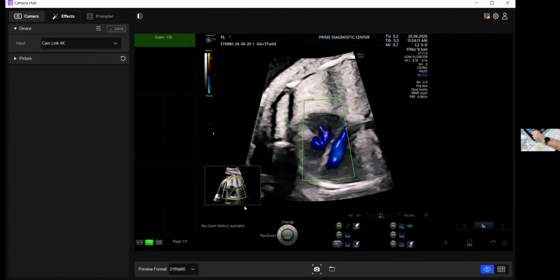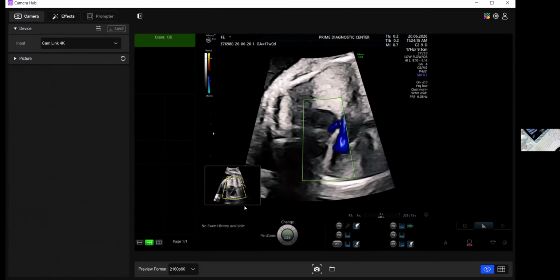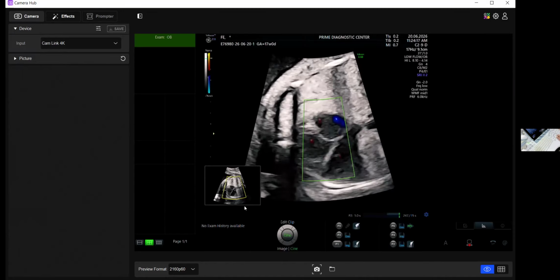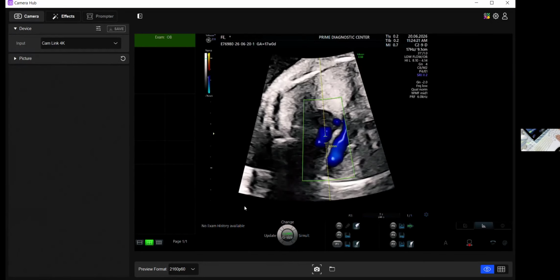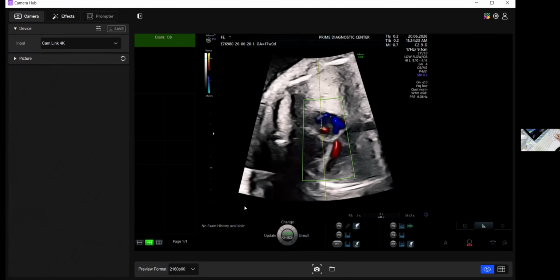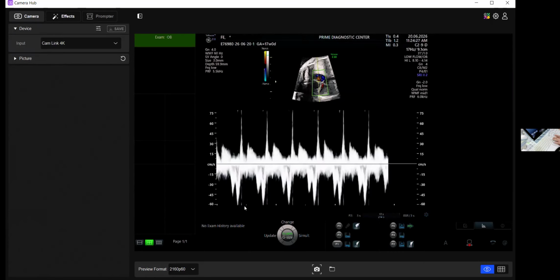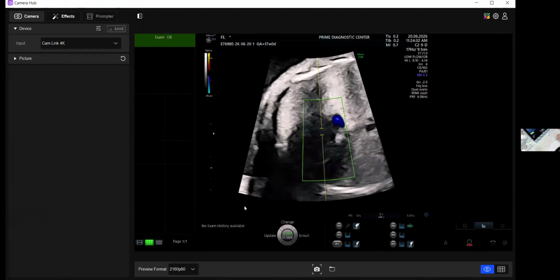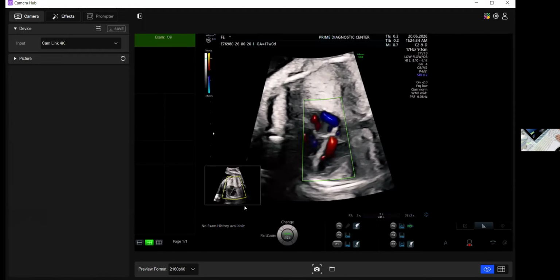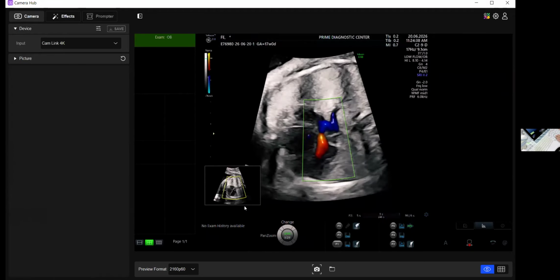And then I can see some small whiff of tricuspid regurgitation, not very sure, but we put the pulse Doppler here and kind of confirm whether it is TR or not. Maybe small, very early. This is what you are getting, but not convincing. So forget about it.